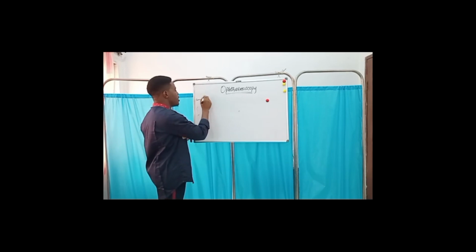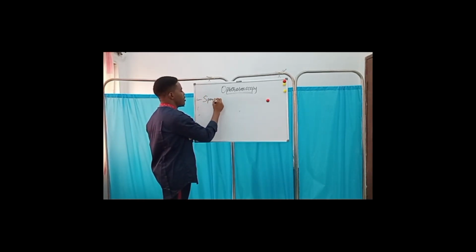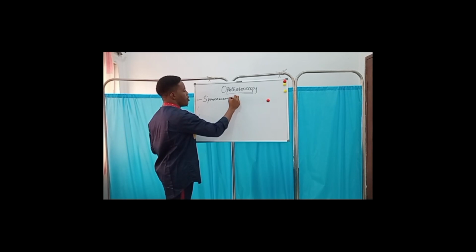Very, very important. The spontaneous venous pulsation.